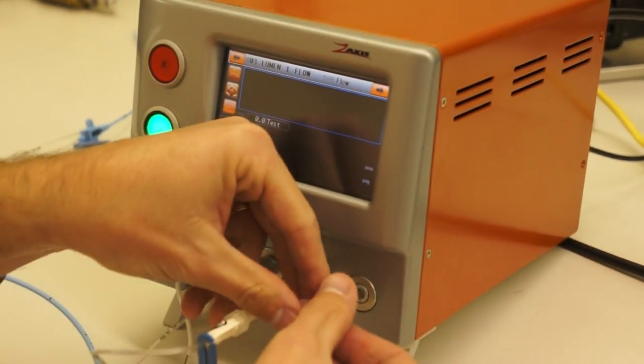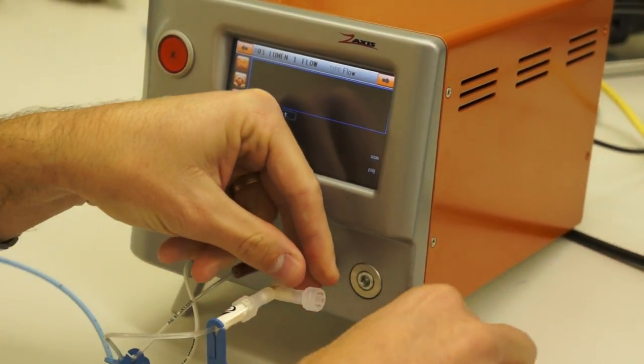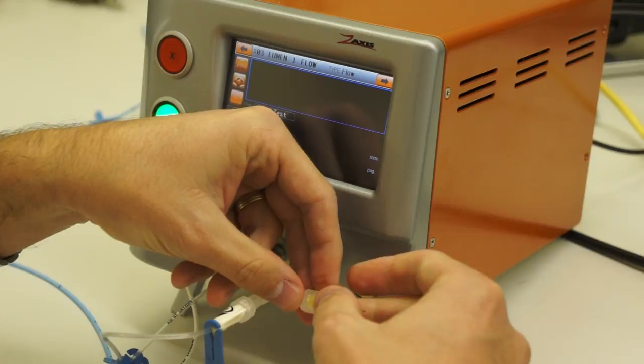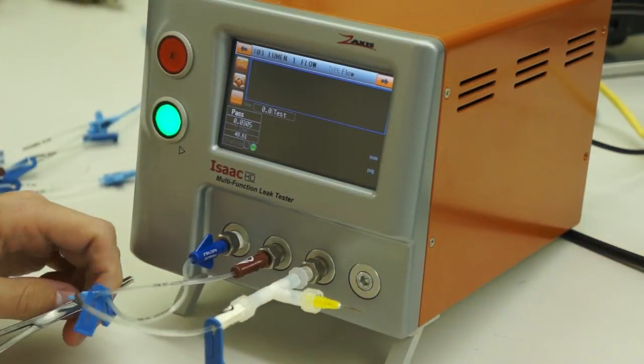I've configured the tester to introduce a 5 cc per minute leak rate to lumen 3. We'll run that sequence of tests again with the leak in it.